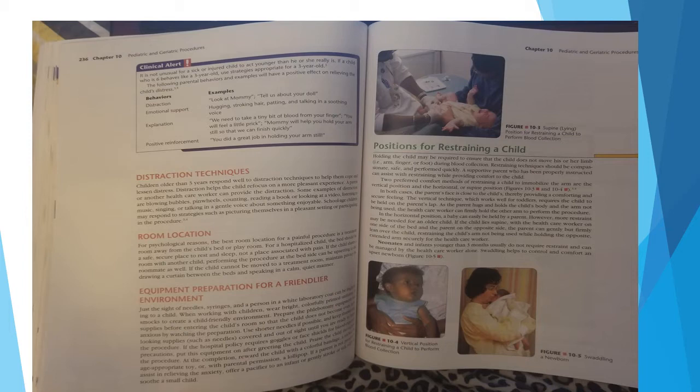Positions for restraining a child. Holding a child may be required to ensure that the child does not move his or her limb, such as arm, finger, or foot, during blood collection. Restraining techniques should be compassionate, safe, and performed quickly. A supportive parent who has been properly instructed can assist with restraining while providing comfort to the child.